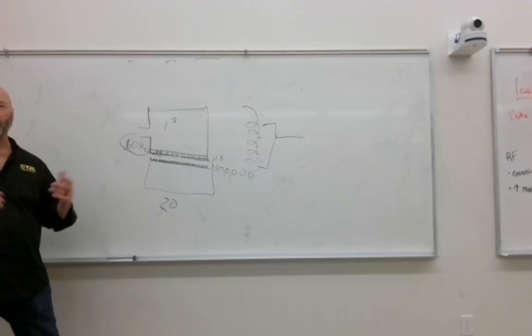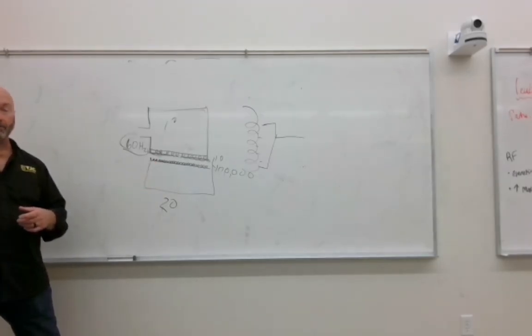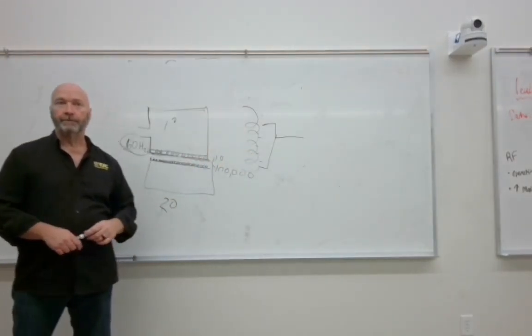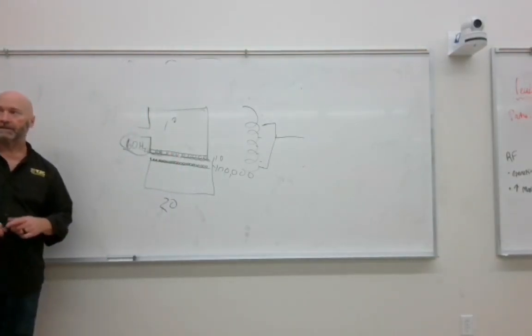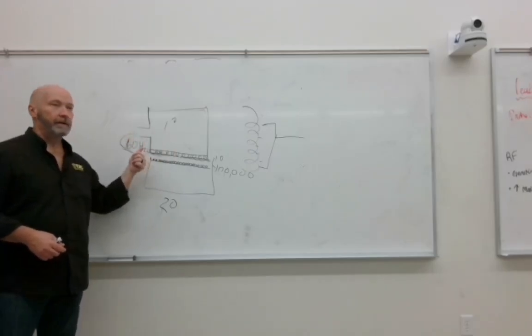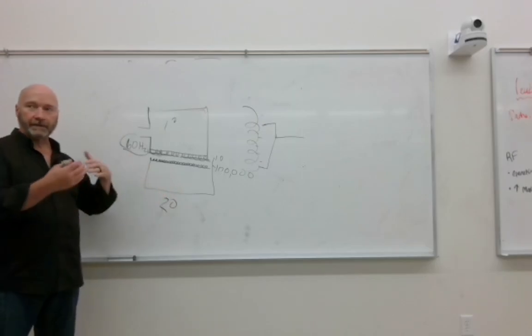And then you've got the MA selector, which really works off the same thing. They talk about it being precision resistors, and I mean that's true. But if they're going to call it a rheostat, it works off really the same principle as the auto transformer. Right, so you've got auto transformer, MA selector, step up, step down transformers, all pretty much working off the same principle, and that is primary side alternating current sets up a changing magnetic field. Secondary side, we induce electric current depending on that turns ratio.